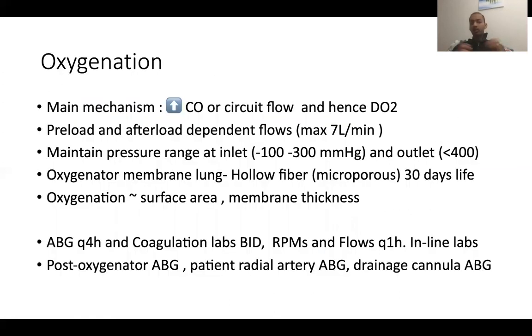Okay, oxygenation first is the most important part of ECMO, and then also comes ventilation, which is carbon dioxide. So for oxygenation, the main mechanism is increasing cardiac output, or increasing the flow of blood through the circuit.